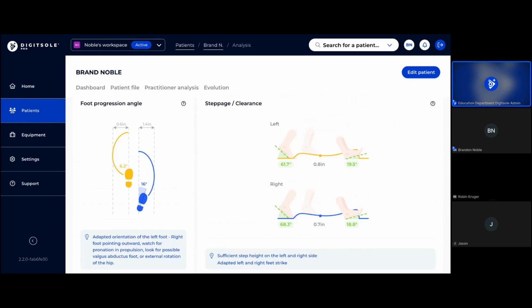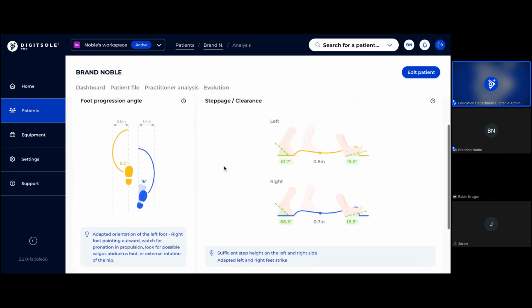So it's that open pack position on the hip. It can swing a little bit more like a pendulum, especially when he's pushing off so hard with his plantar flexors, which we saw. Because that's not normal for him, it goes into a longer stride length because he's cranking that thing through. It's swinging through. So this is definitely a strategy of someone who has some acute low back issues.